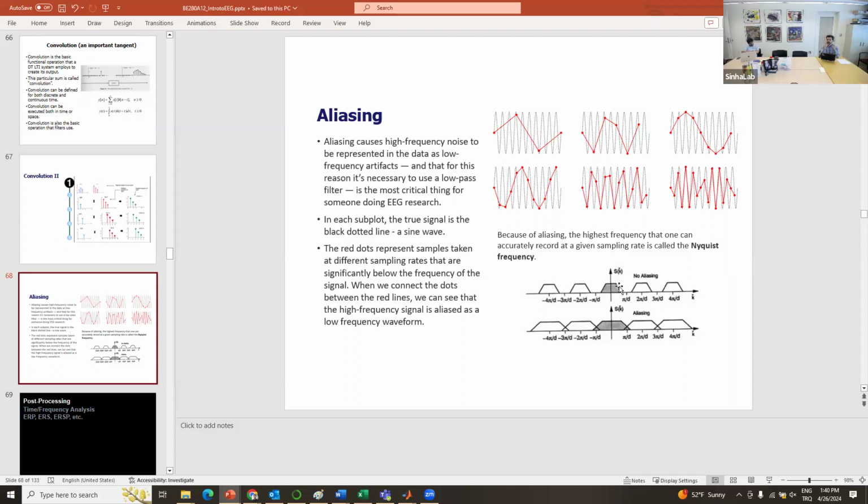The reason I used the frequency domain representation of the signal is that it's easier to understand. But if I want to give you an example from real life about the aliasing phenomenon, you can think of the wheel of a car, which has a little pattern. If it moves at a certain speed, maybe faster than the sampling rate of your visual system, the wheel starts looking like it is actually turning in the other direction.